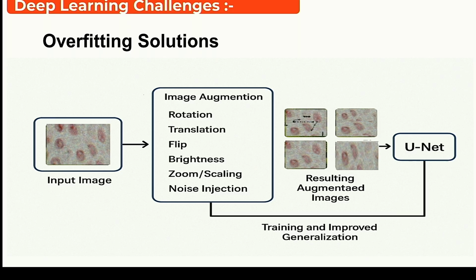Then we feed it to the models. Why do we do that? Because we want to prevent the model from seeing the same image in the second batch, to prevent this model from this action. So we solve this problem using this technique.